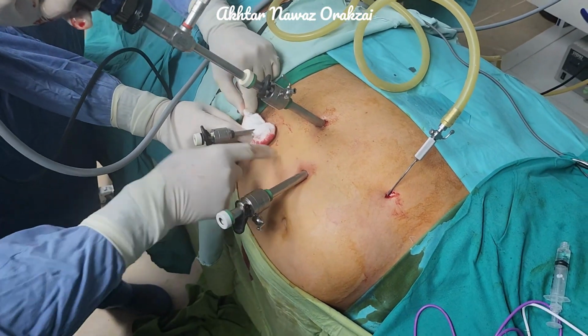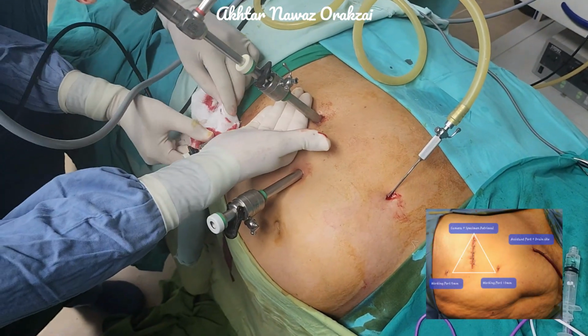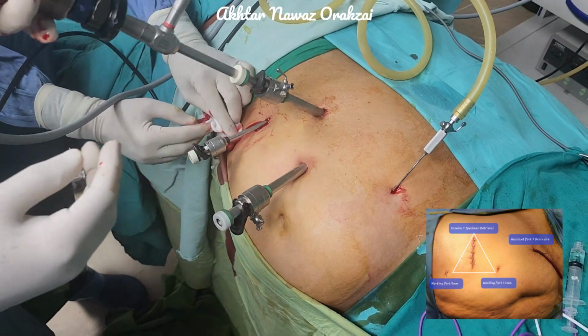So you see here the ports now are 10 centimeter, 7 centimeter and 7 centimeter. And that's it. Thank you.